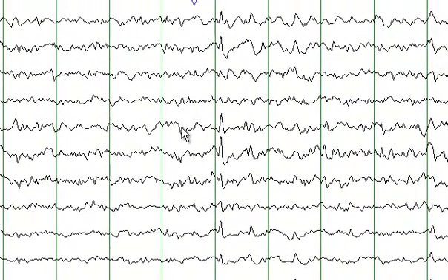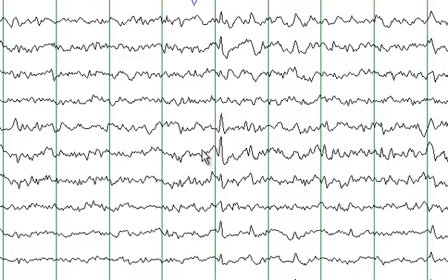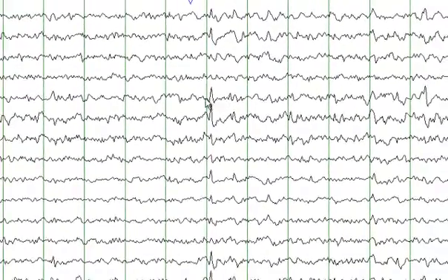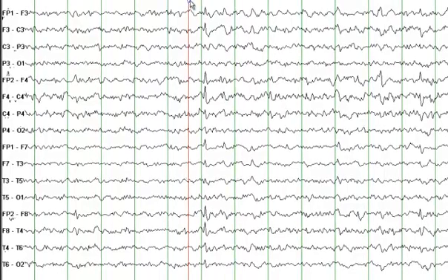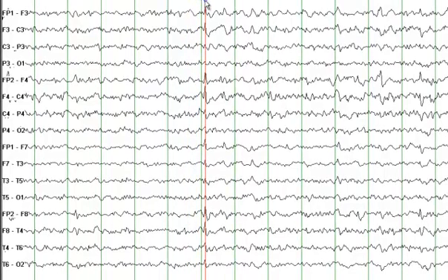Another striking finding on the EEG is these sharp waves. These are located at the left frontal central as well as the right frontal central head region. If I draw a line, you see the sharp waves occur more or less at the same time at all those electrodes.